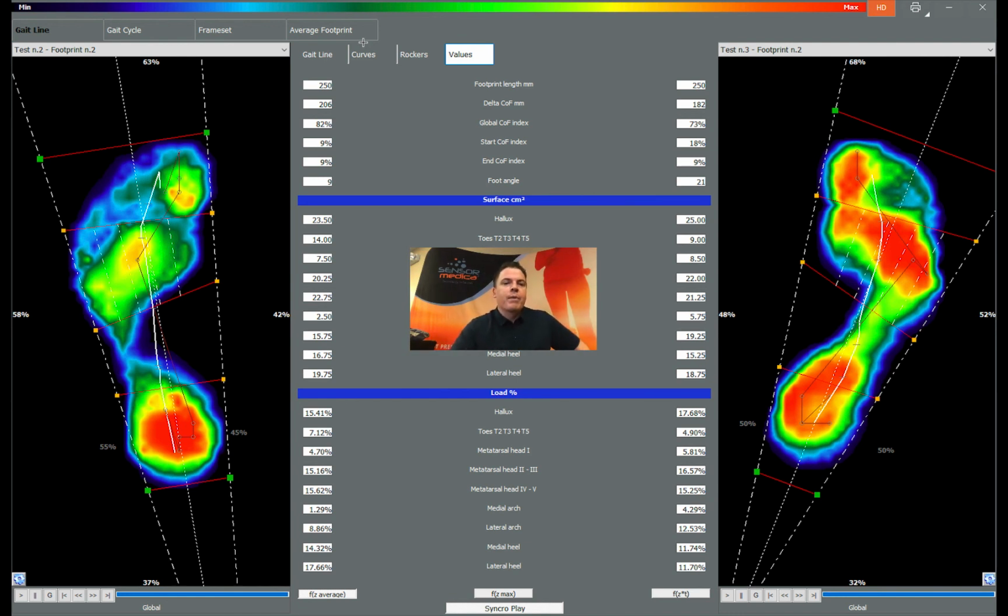So that's why we do these gait analyses. Every injection patient that we see, before we see them, we'll do a gait analysis to see what biomechanical issues we may be dealing with, so we can correct them to get them long-term better results.